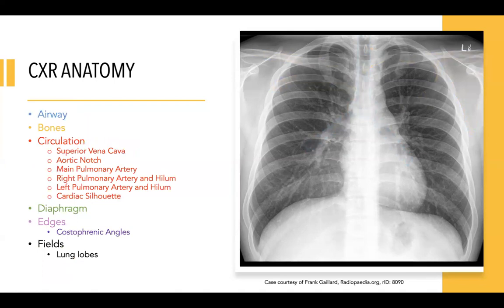Circulatory assessment includes examining cardiac features and vasculature. The cardiac silhouette should be no more than 50% the width of the thorax. The AP approach to chest x-rays may result in falsely enlarged cardiac imaging. However, cardiomegaly and pericardial effusion are possible etiologies of a large cardiac silhouette. So again, it's important to note x-ray rotation or approach.